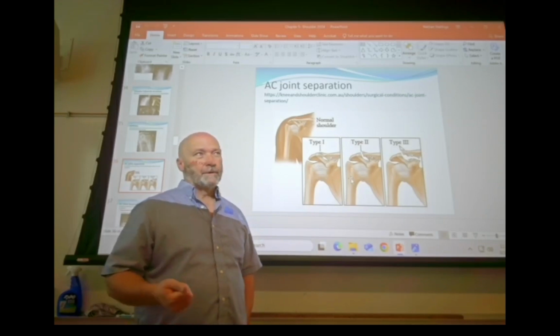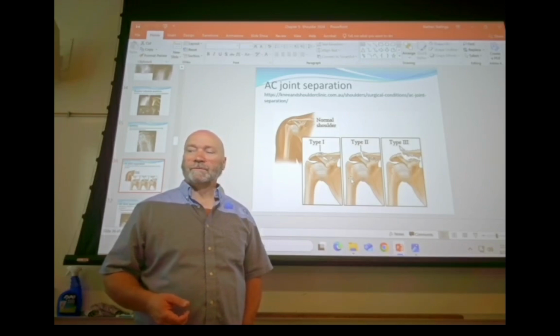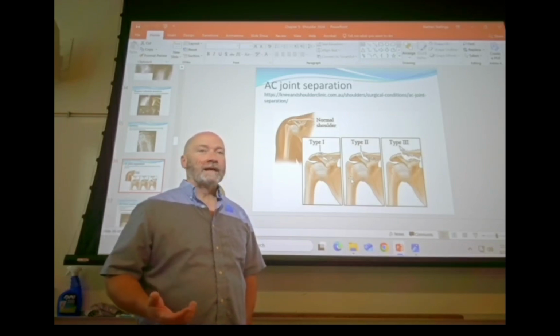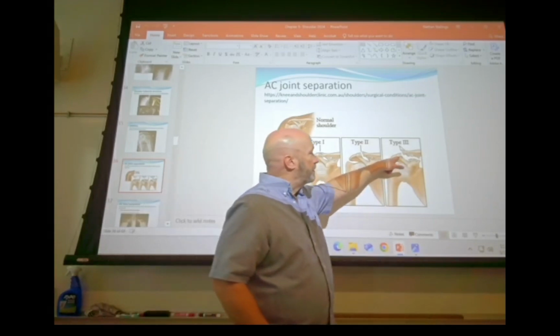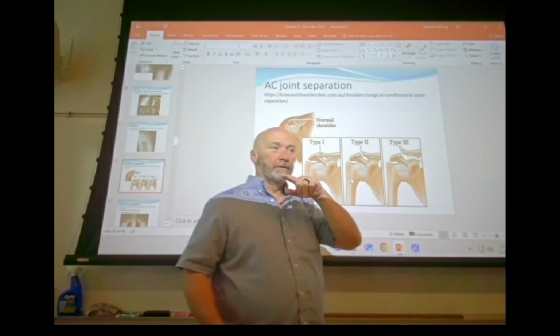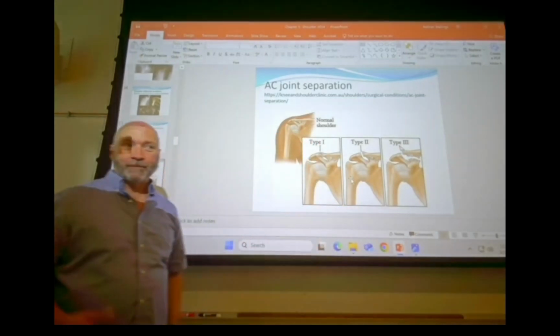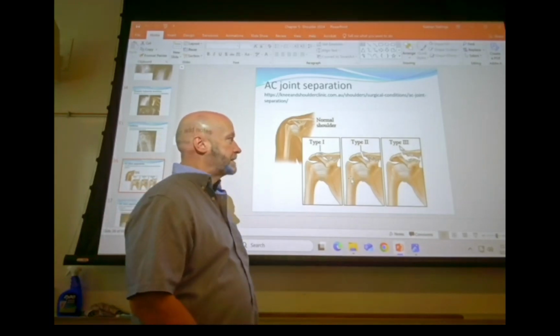A gridded cassette probably weighs 10 pounds or so. We've got one in the lab. So they're kind of heavy, right? They said that you could see, pull his shoulder down and his clavicle would just be sticking out, right? So it's pretty bad, but he made it all the way through school. I assume he's had it repaired since then.